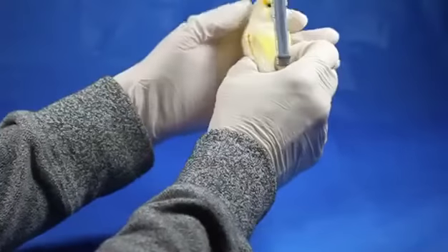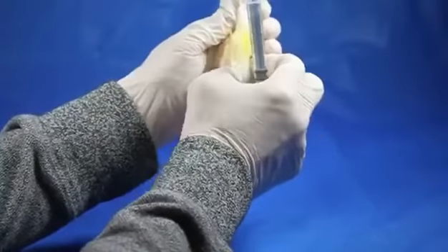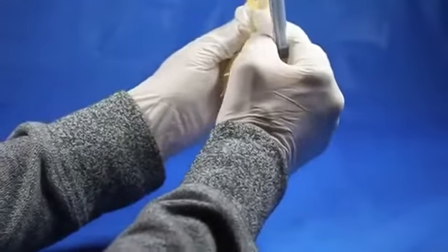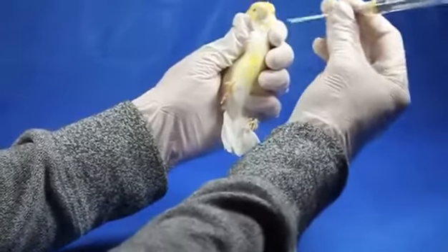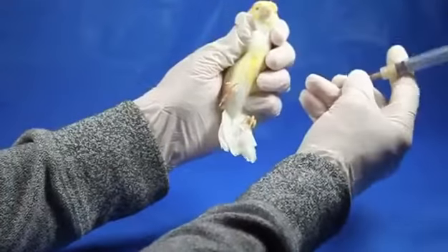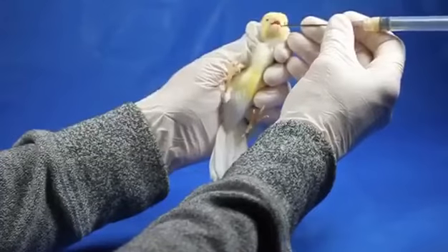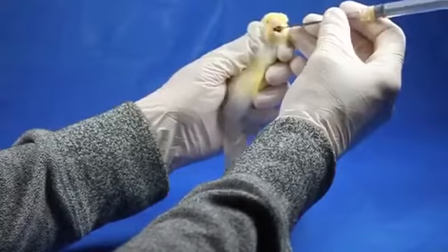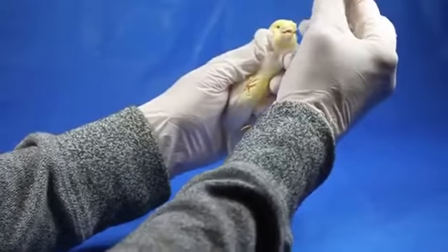Now I'm going to take the bird and very gently, by putting my fingers under his chin, I'm going to gently straighten his esophagus. I'm going to stretch his neck just a little tiny bit and make sure the esophagus is straight so the tube can go down easily. Then I'm going to insert it in his mouth from my right side to the left side and drop the tube down.